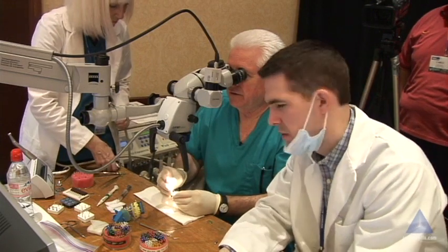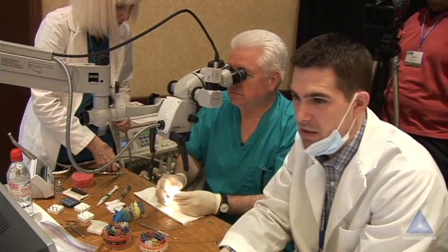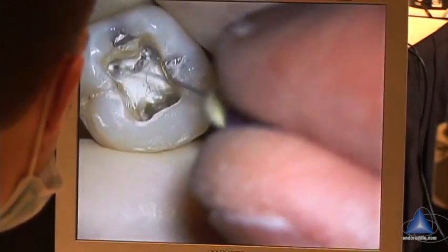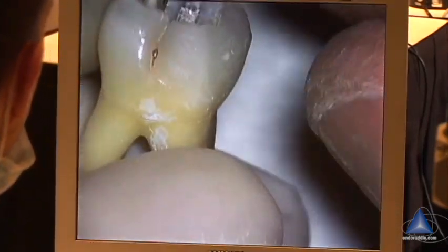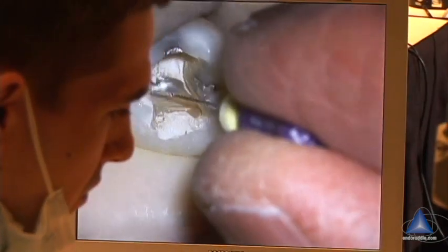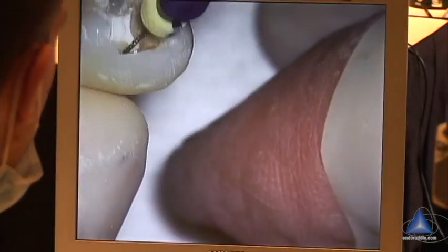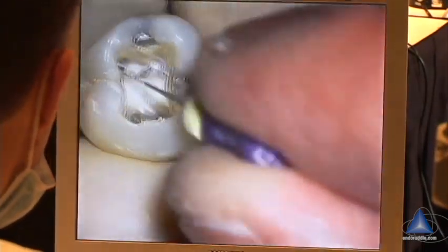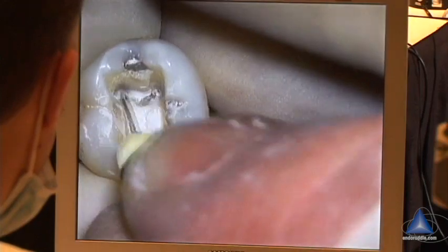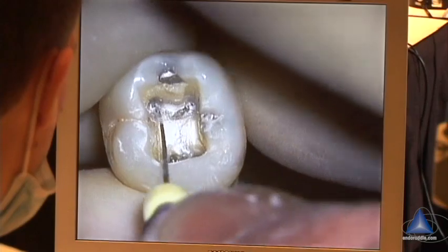Now we can take our size 10 and drop it in. Is it any better? A little bit — still leans, just the direction of the root, I think. It's definitely better. It's not — I mean, you had really good access. That's like standing up straight. I think it'll stand up even more as we shape down maybe four millimeters below the orifice.